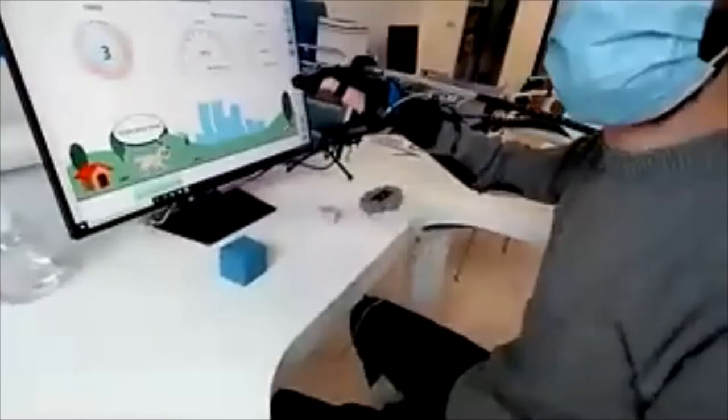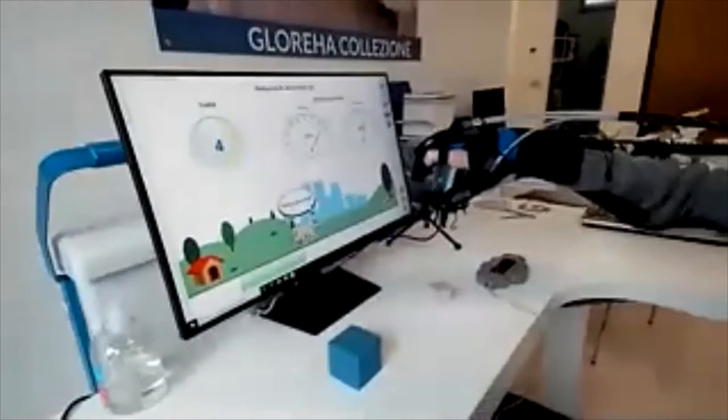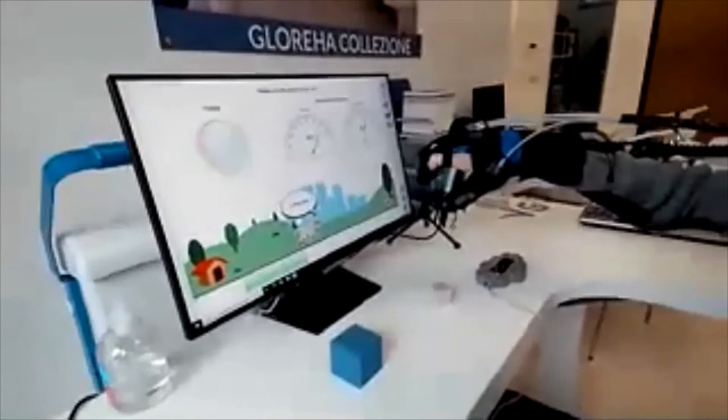On the screen, the therapist has immediate feedback on the patient's performance, both in flexion and extension. Each patient has their own profile, so all of this data will be properly stored and summarized in graphs, allowing the therapist to assess the patient's progress over time easily.